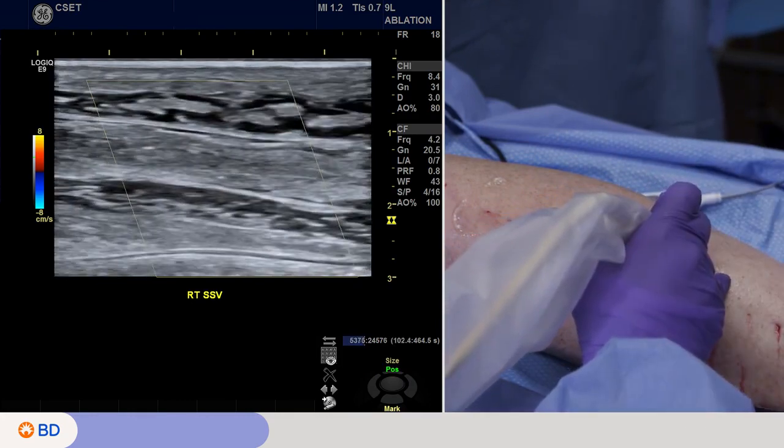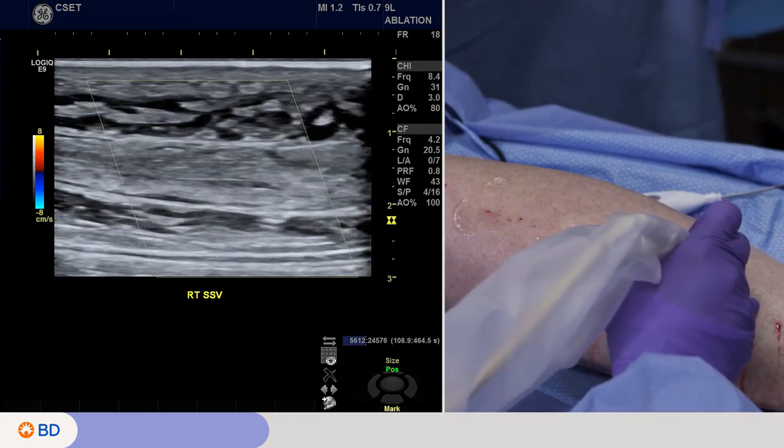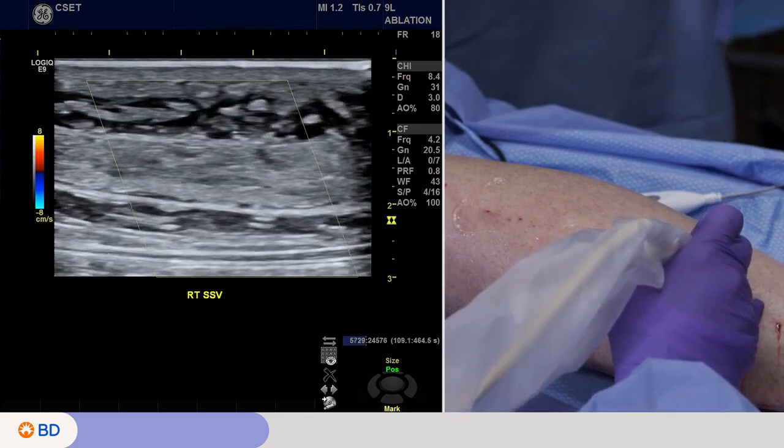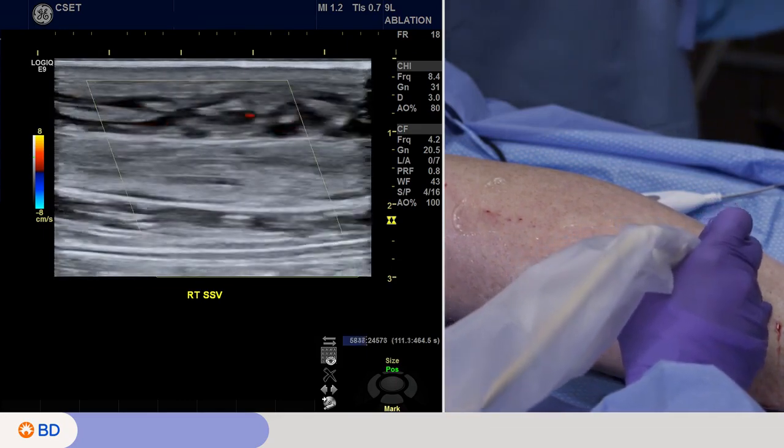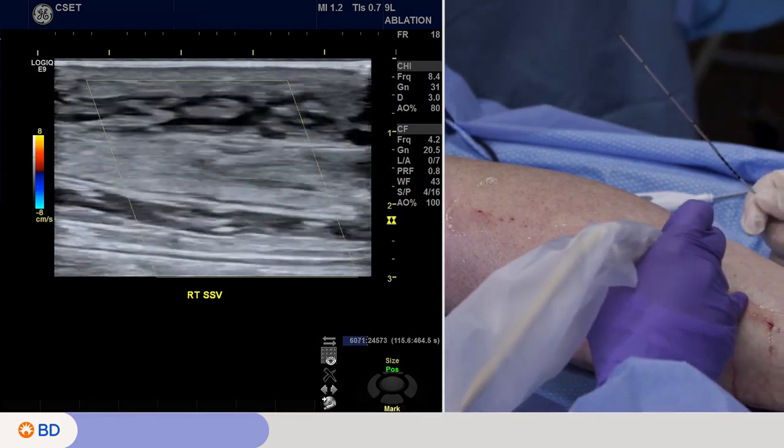If you've given the treatment and the therapy, you're creating the intense inflammation and injury to the wall, and over time that's going to fibrose and certainly will thrombose in the near term. It looks great.